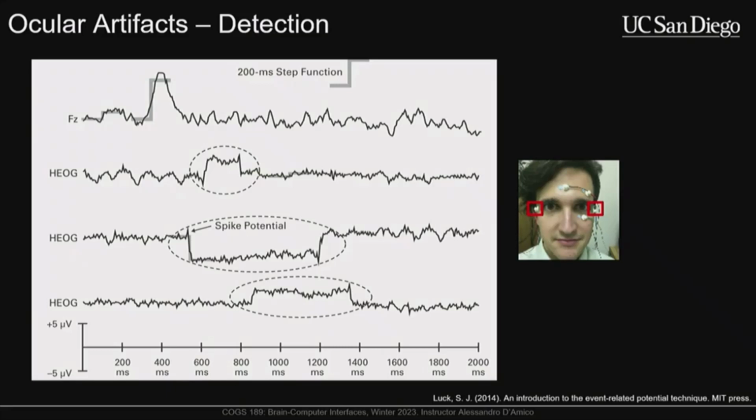Again, in reality, you tend to record these from simple voltage thresholding if your signals are really clean, but the step function is a little more deliberate and it can catch smaller amplitude EOG movements. Now the VEOGs look more regular. They don't quite look like step functions. They look more like peaks and troughs, similar to what you'd see from a blink. It really depends.